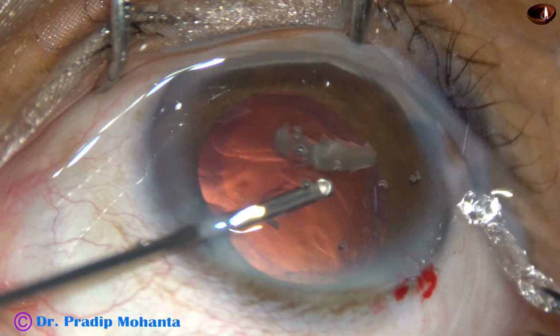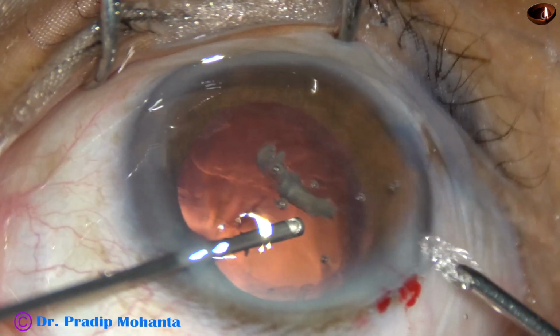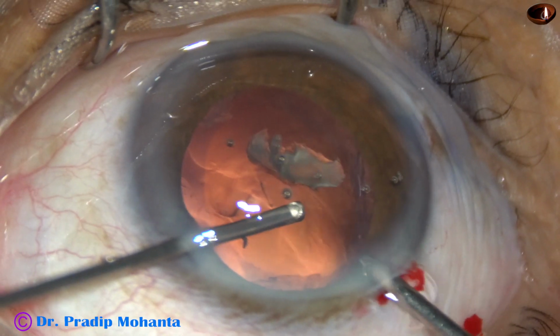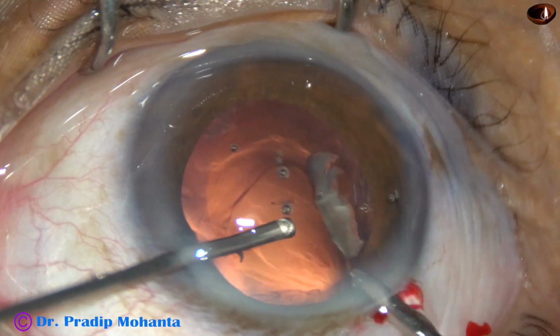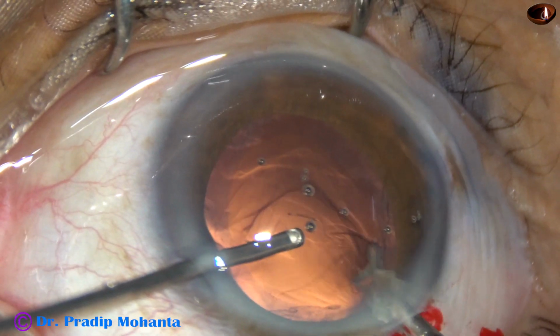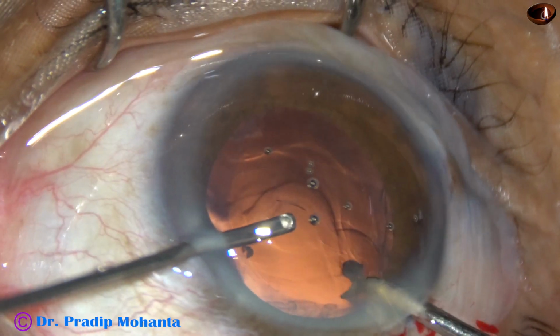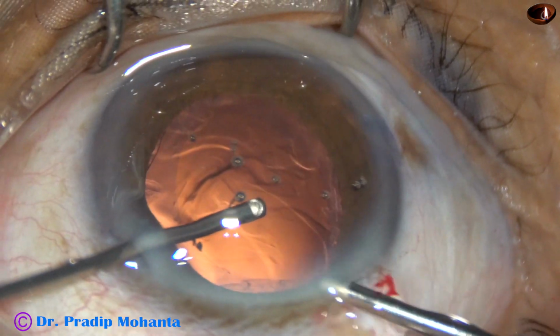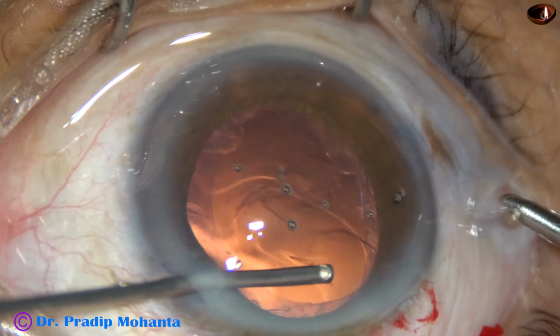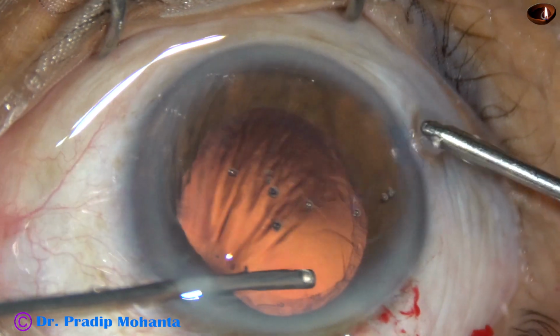I don't want this nuclear fragment to sink into the vitreous, so I try to remove it just by irrigation.